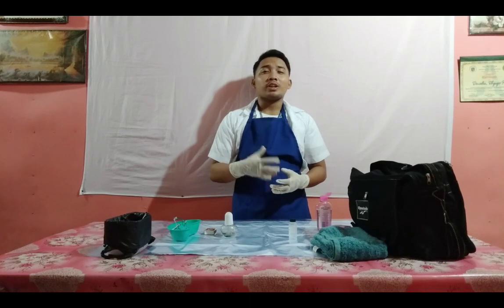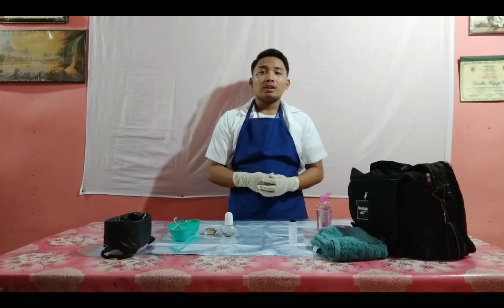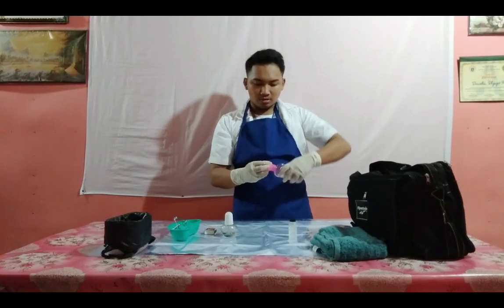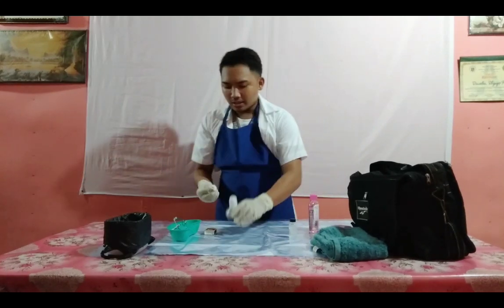Now I'm going to disinfect also the lamp and the plastic lining with the use of sterile cotton balls. We'll get another cotton ball and I will disinfect the alcohol lamp.